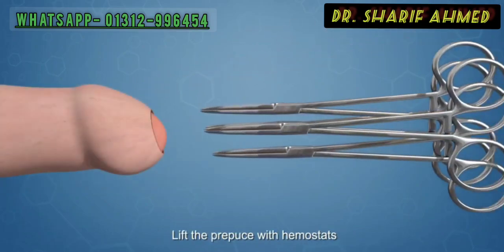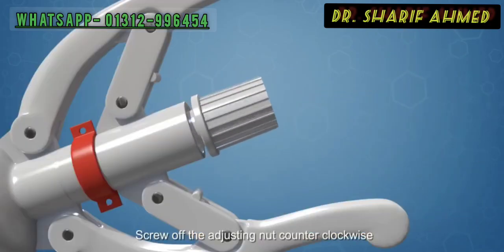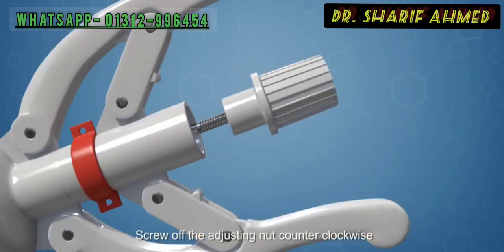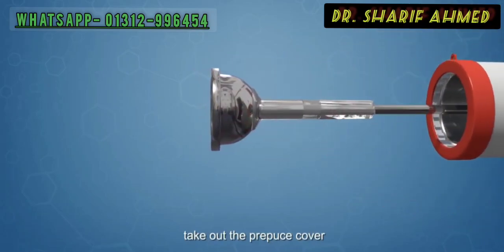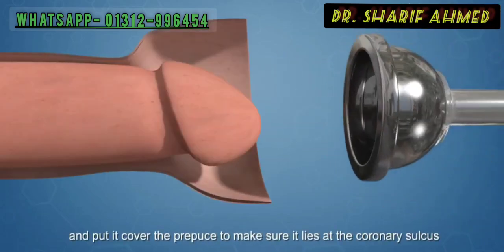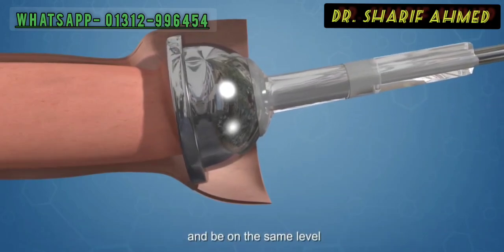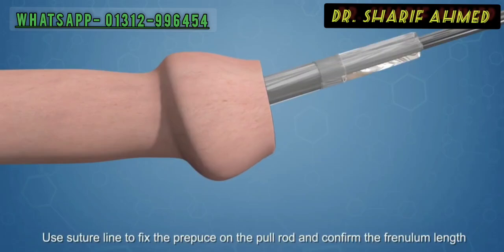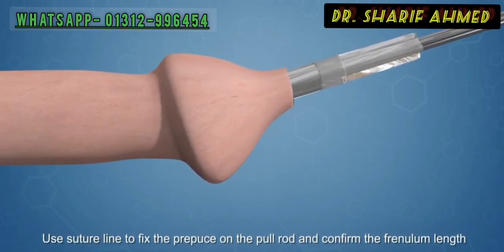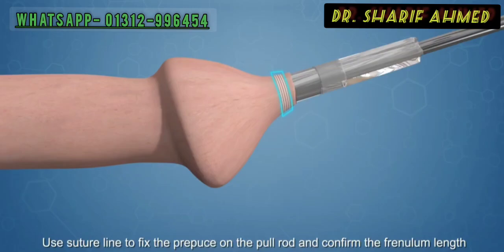Lift the prepuce with hemostats. Screw off the adjusting nut counter-clockwise. Take out the prepuce cover and put it over the prepuce to make sure it lies at the coronary sulcus and is on the same level. Use a suture line to fix the prepuce on the pull rod and confirm the frenulum length.